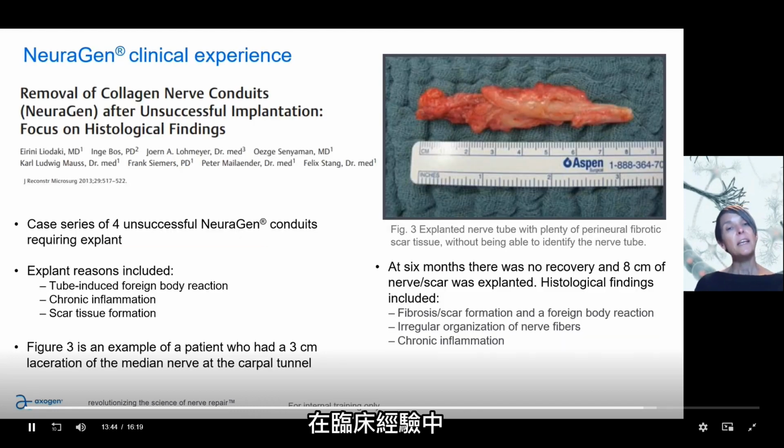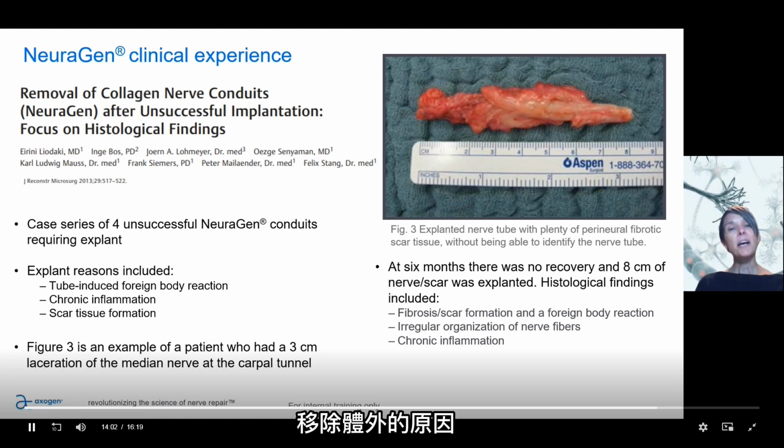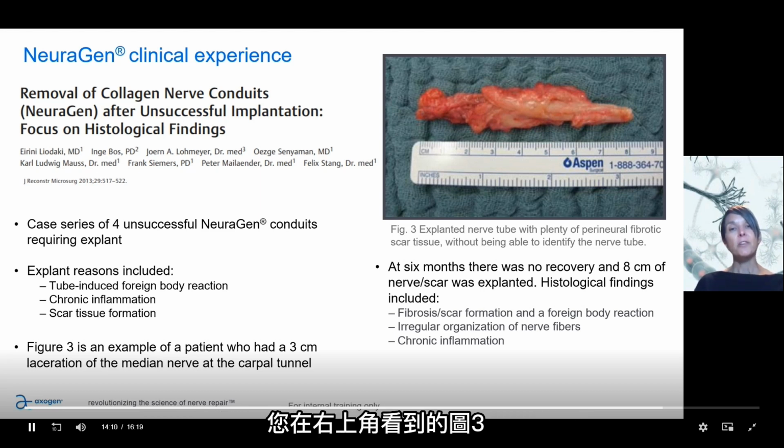Now, in the clinical experience, there is a case series that has been published that has looked at the removal of collagen nerve conduits due to unsuccessful implantation. So this was a case series of 4 unsuccessful conduits. And the explant reasons included a foreign body reaction, chronic inflammation, and scar tissue formation. And so figure 3 that you see on the top right is an example of a patient who had a 3-centimeter laceration of the median nerve at the carpal tunnel. And at 6 months, they had no recovery.